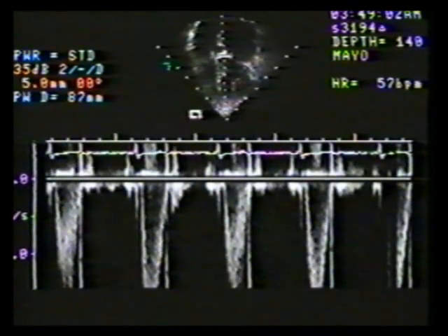This is the same patient. The small image is an apex down display of the apical long axis view. The pulsed wave sample volume is positioned near the sewing ring of the aortic prosthesis. The resultant velocity spectrum aliases at 1.5 meters per second.